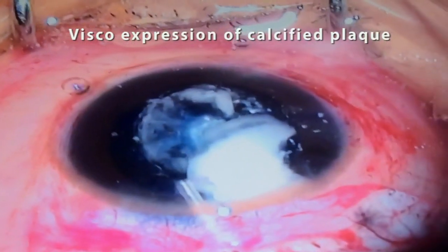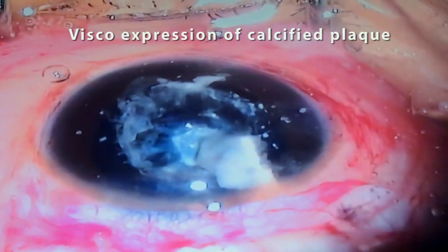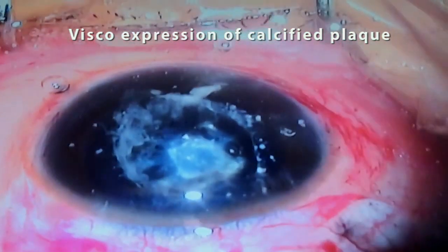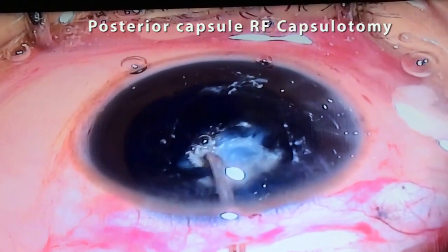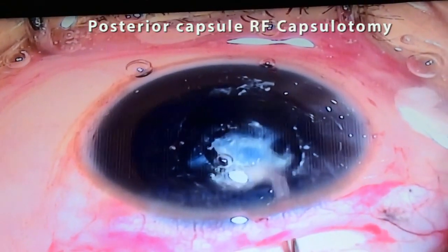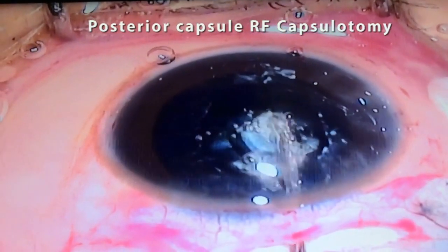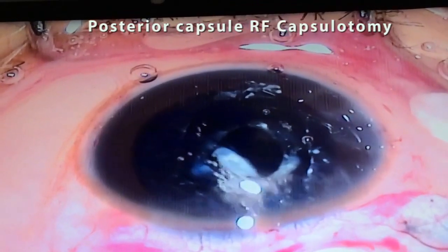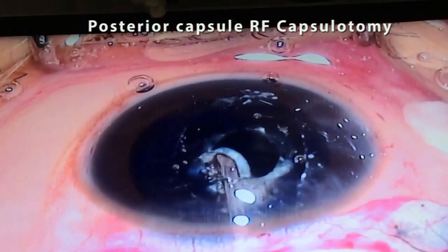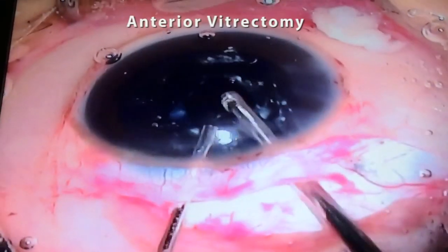The cataractous nucleus can be delivered out with the help of viscoelastic substance. Posterior RF capsulotomy can be performed in a similar manner as anterior capsulotomy, keeping in mind the vitreous prolapse while doing so. The prolapsed vitreous can be removed with the help of a vitrectomy cutter.